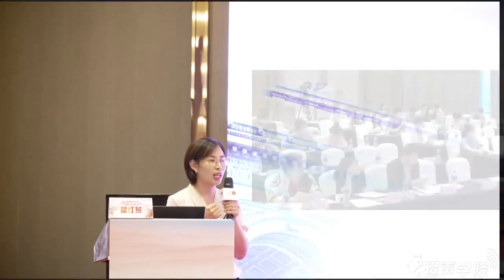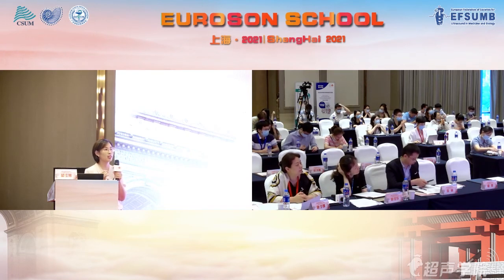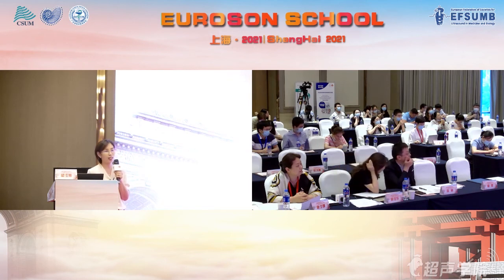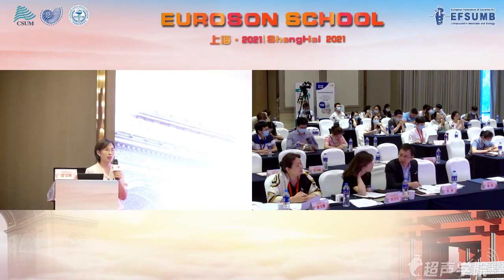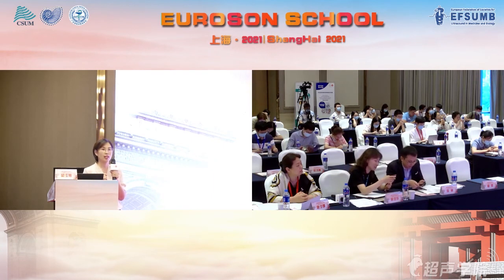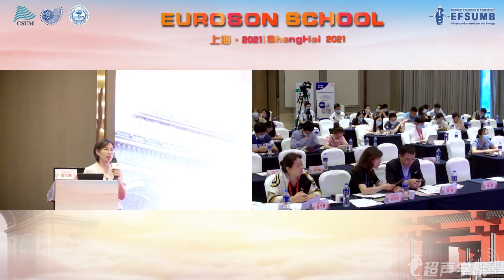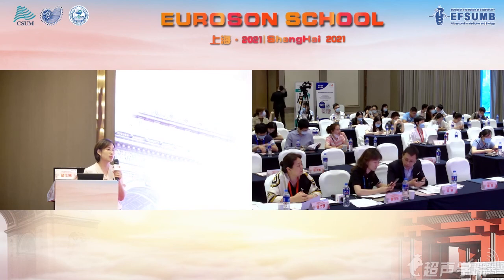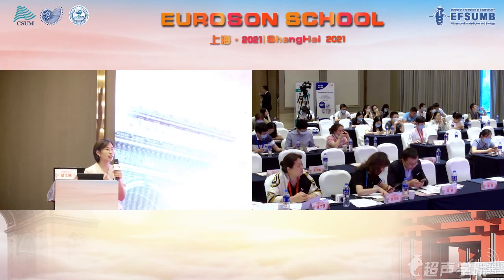And the solid pseudopapillary tumor consists of different proportions of solid and cystic components. The solid components usually show hyperenhancement in the arterial phase. So after CEUS, we found that the enhancement pattern of this lesion is not fully consistent with any one of the pancreatic tumors. Only the hyperenhancement in the arterial phase conforms to the neuroendocrine tumor and the solid pseudopapillary tumor. But with the neuroendocrine tumor, the patient often presents corresponding symptoms, and the age of patients with solid pseudopapillary tumor is younger than this patient.